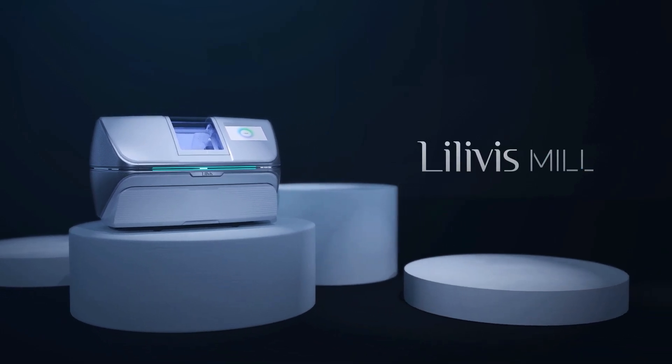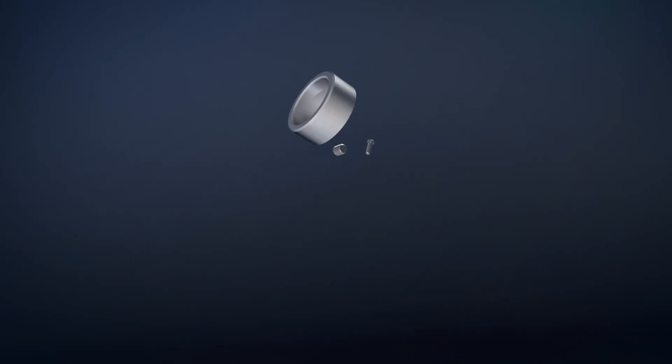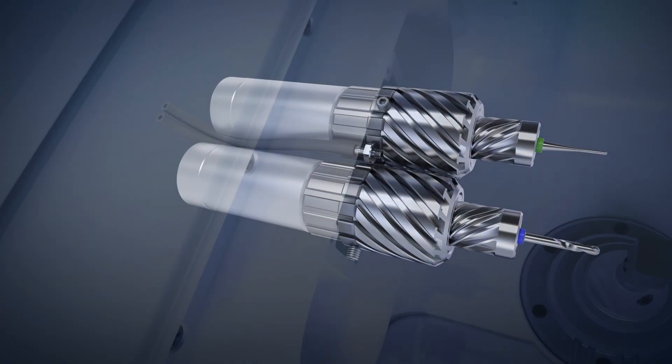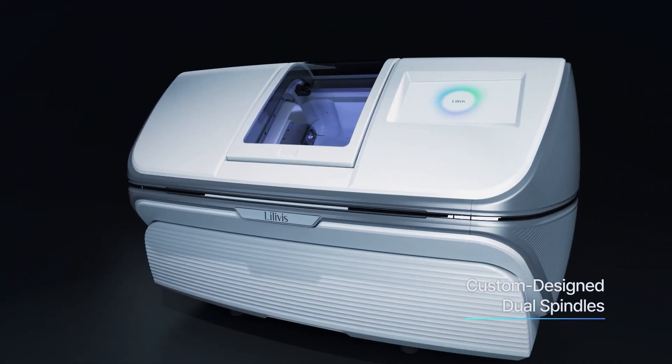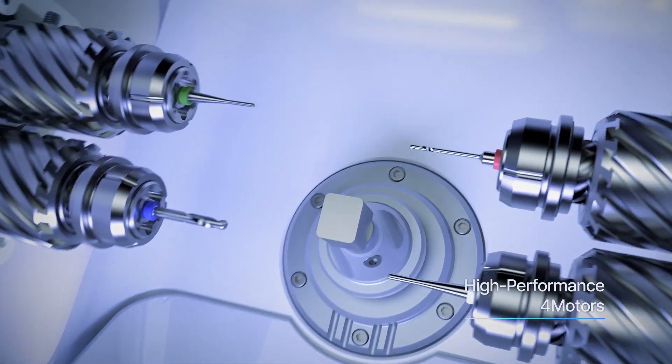The Levis Mill. The difference in technology creates a distinction in performance. With a high-performance quadruple motor reaching up to 50,000 RPM and our customer-designed dual spindle, precise restorations can be crafted promptly.